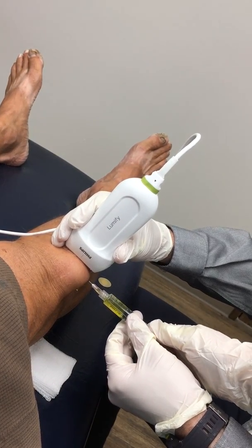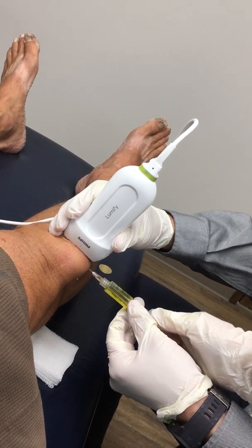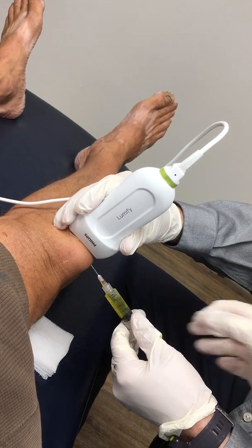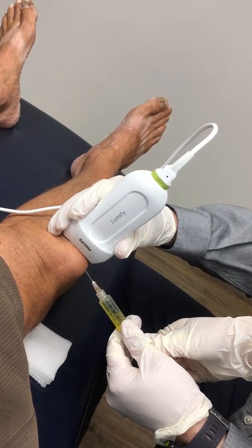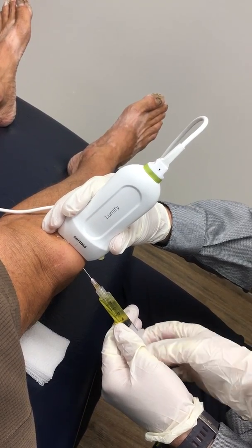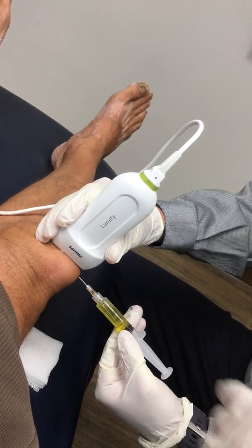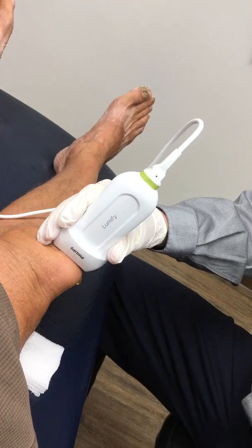Okay. So you can see it's just really, really thick fluid. I'm going to move up a little bit there. Okay, it's a different pocket. I can see in ultrasound the different pockets of his cyst and inflammation. It's just this really, really thick material. That's great. And what I might try doing, Larissa, I'm going to try to manually compress here for a second.